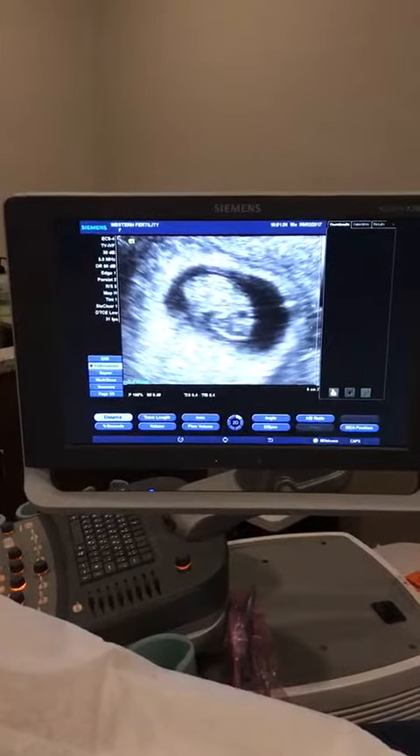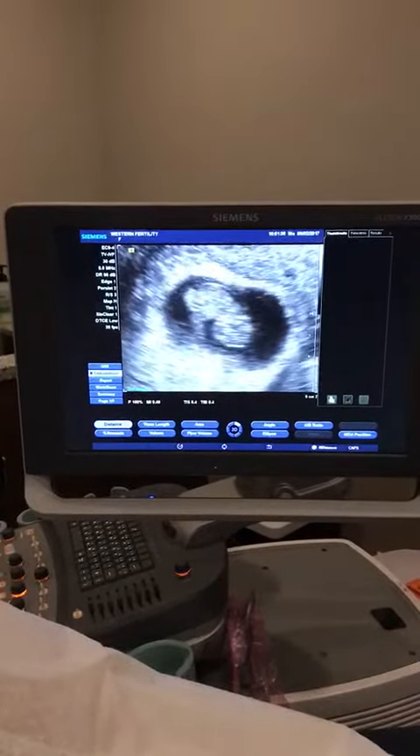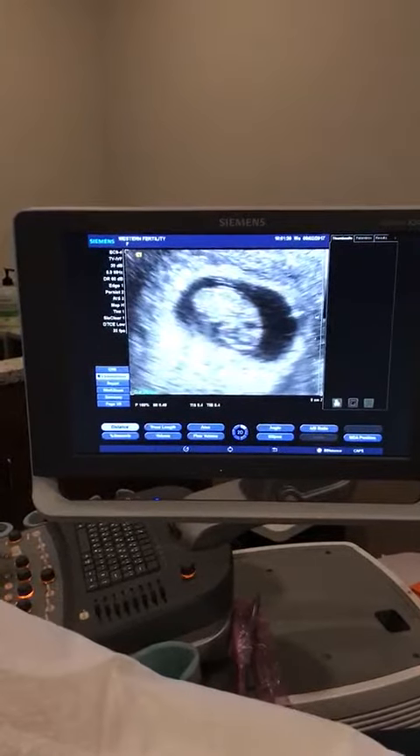So we have the head over here, this is the back, this is the little behind. You guys see the umbilical cord — the wonderful part right there.